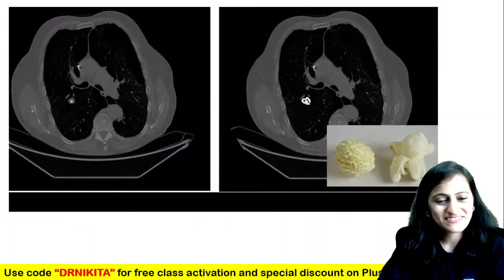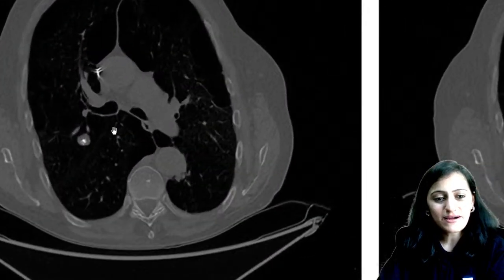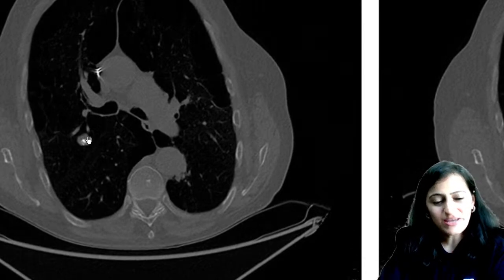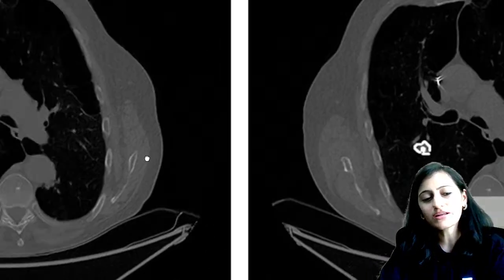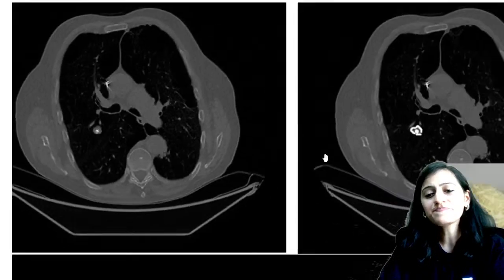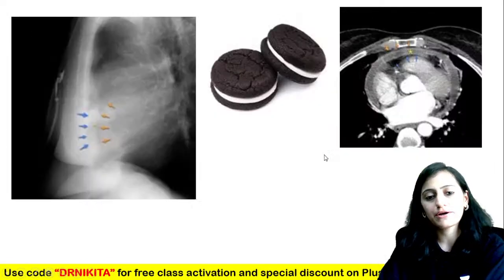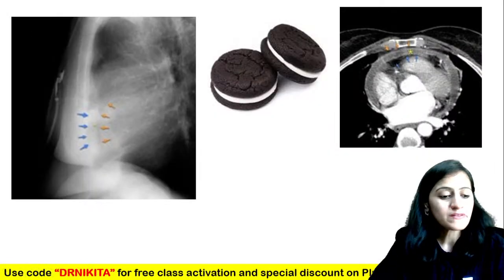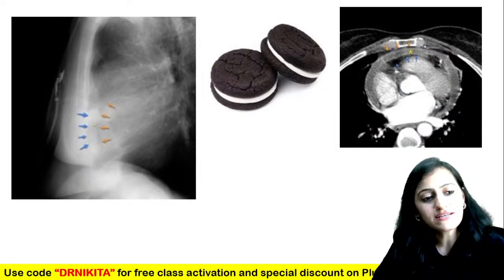Look at this CT scan showing a lesion in the lung with popcorn calcification — this is your pulmonary hamartoma.